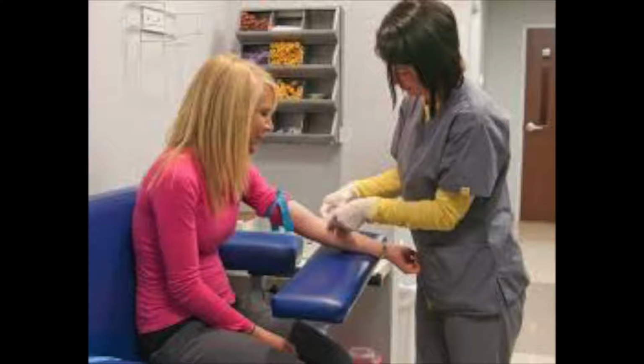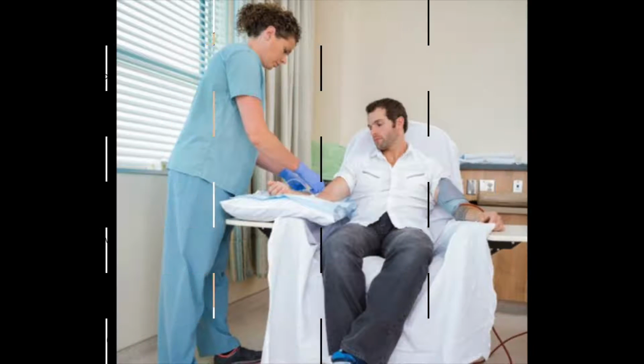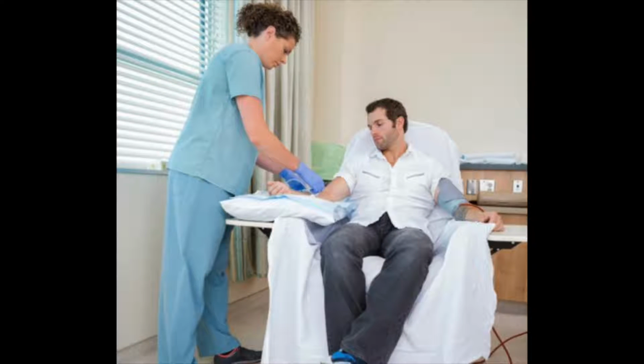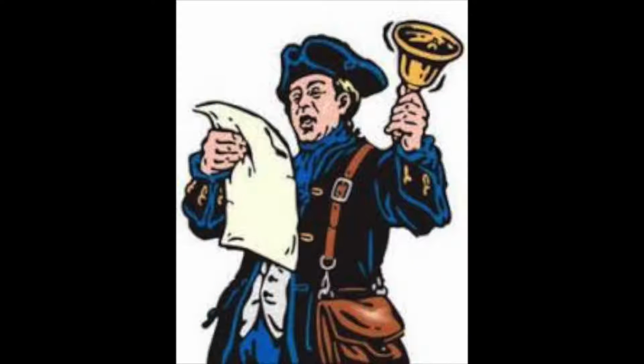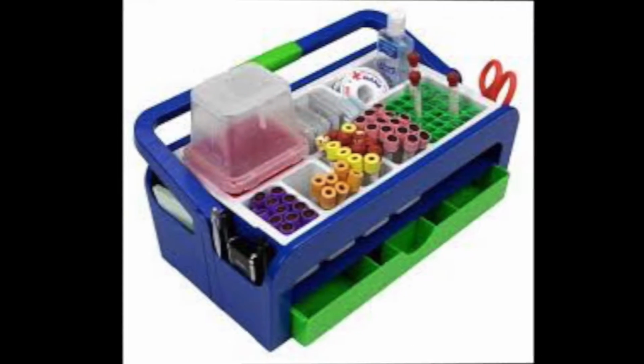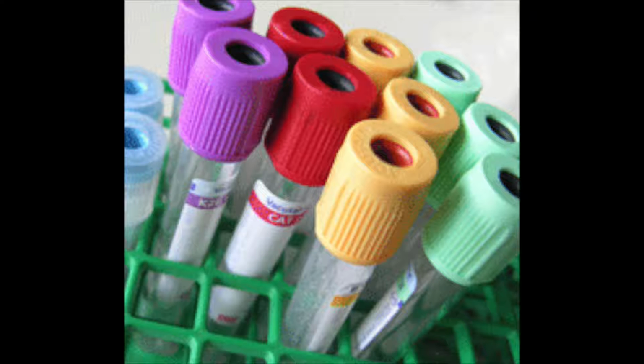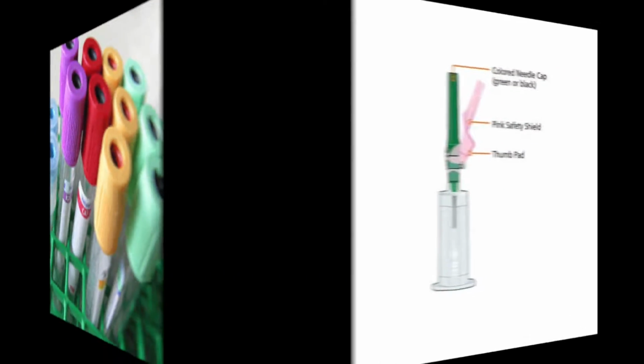The medical assistant will position the patient appropriately to provide access to the antecubital space. The medical assistant should position him or herself so as to access the patient's arm laterally. The student will read aloud the labs ordered on the signed consent form associated with the phlebotomy module. Demonstrate knowledge of the correct lab tubes and equipment to be selected from the choices available on the phlebotomy cart.